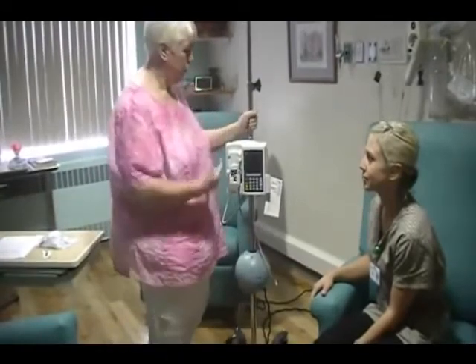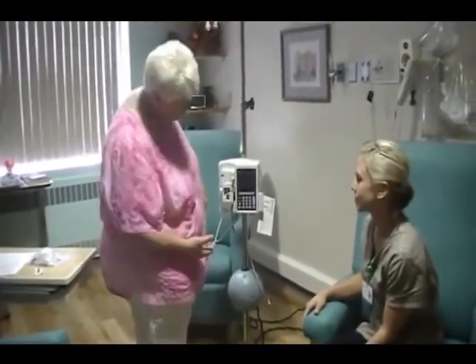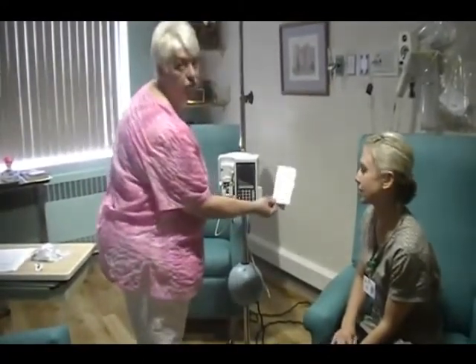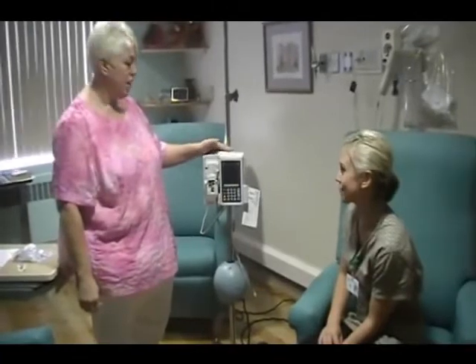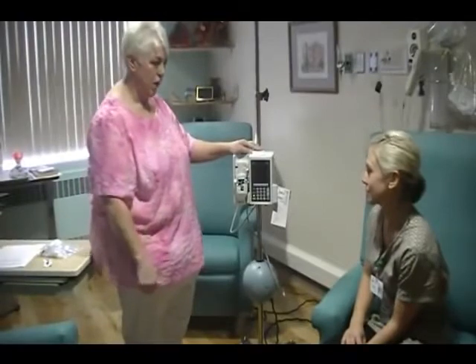Hi, I'm Cindy Sewell and we're doing our annual competency on Plum Pumps. This is a Plum A, and you'll find instructions if you have to troubleshoot on it on the side hanging here. Ann is going to be my student today, and if I forget something or she needs to ask a question, she's going to feel free to do that.